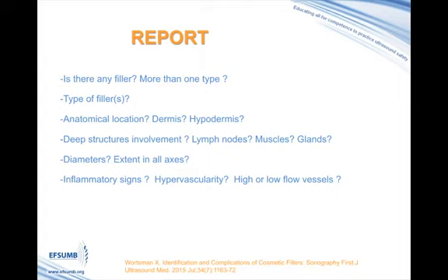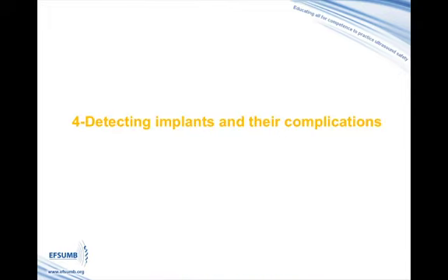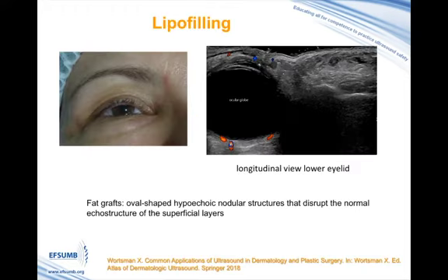The fourth indication is the detection of implants and their complications. One of the most used organic implants is fat, and this is called lipofilling, and we have an example here.